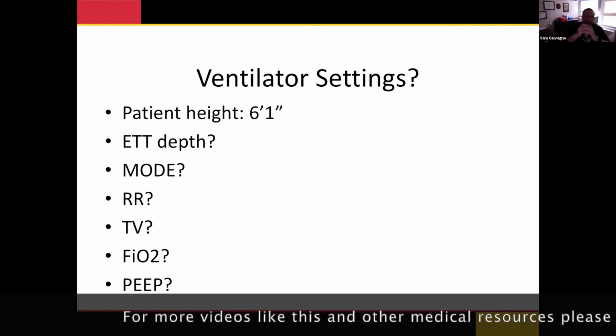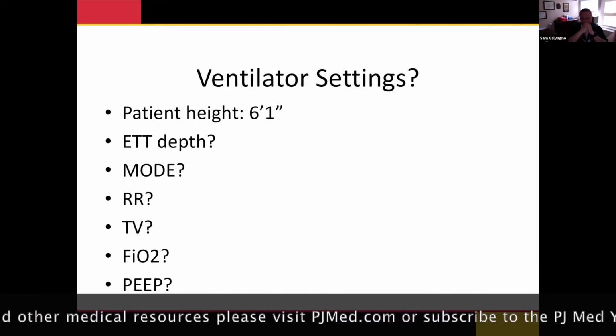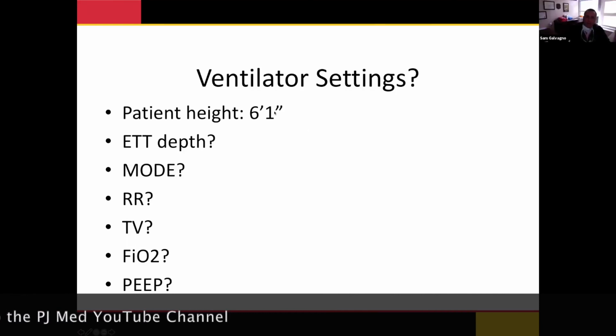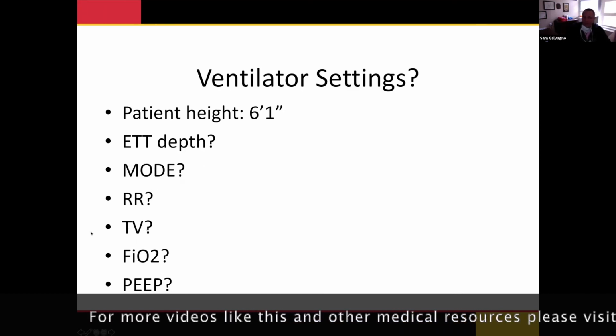So what has anyone got for ET tube depth? What's anyone got for tidal volume for me? Tube 23. Okay, cool. So a little different, because they're 6'1", this guy's a little taller. I will admit that I inflated his height because I just wanted to see if you guys would catch that, and you did. So thank you. Good job. And tidal volume.